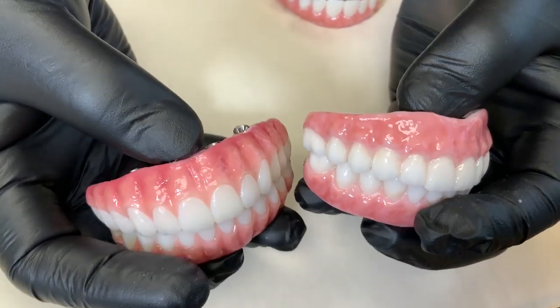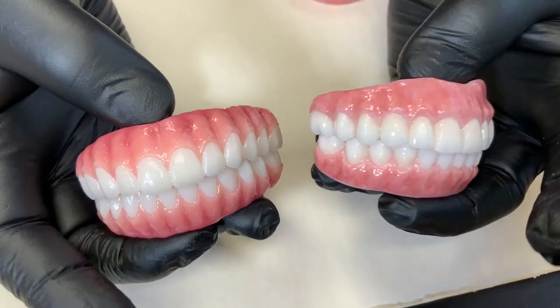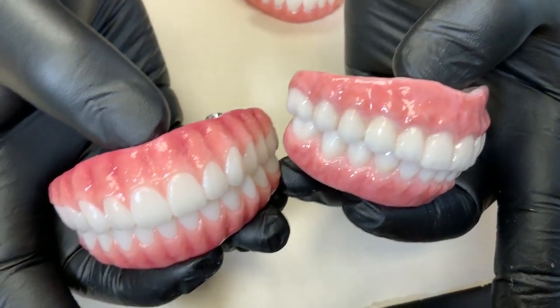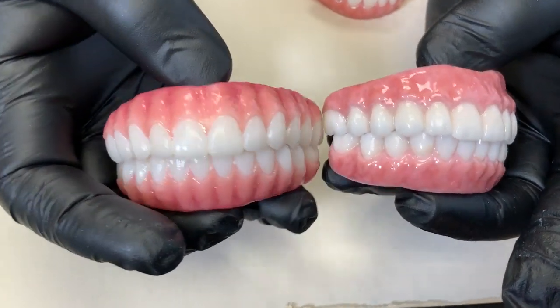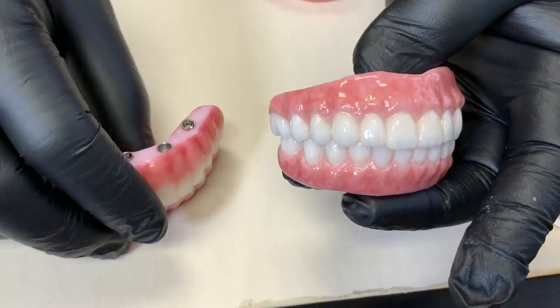This is extreme cases, which means before and after. Which one do we prefer for the zirconia cases?